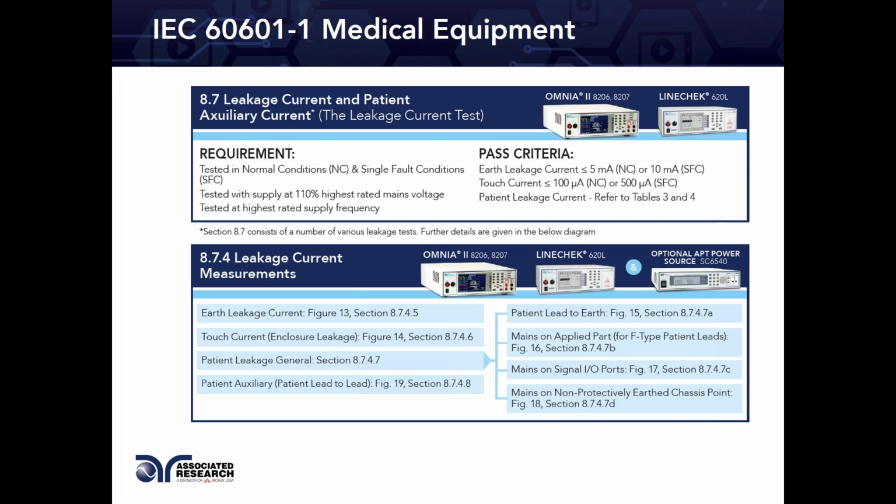What is earth leakage pass criteria? You want to have a normal condition where leakage felt by the MD is less than 5 milliamps. So in an earth leakage test, even though you're doing open neutral, reverse polarity, any kind of conditions, during a normal condition, when the product is plugged in properly, the leakage through the MD should not be more than 5 milliamp. Now, if your equipment is designed properly, if everything is functioning properly, the earth leakage would most likely be less than 5 milliamp.